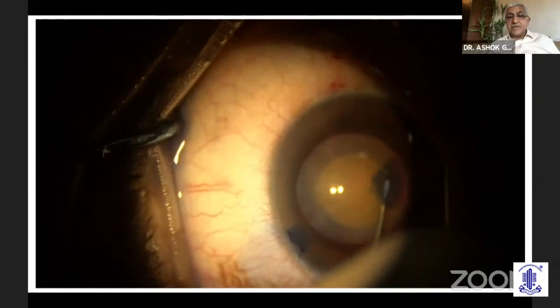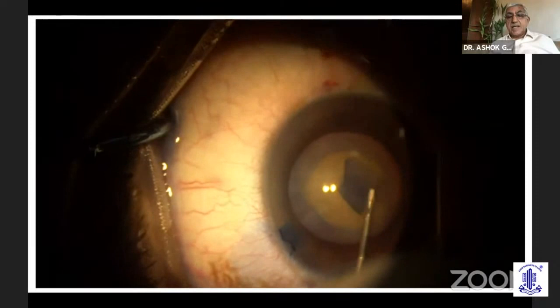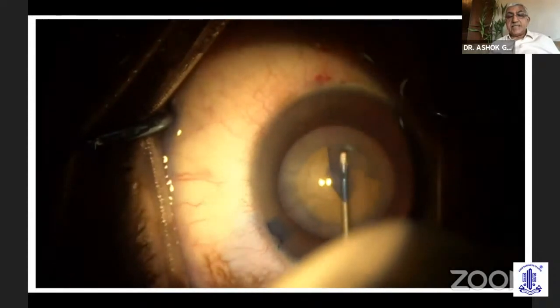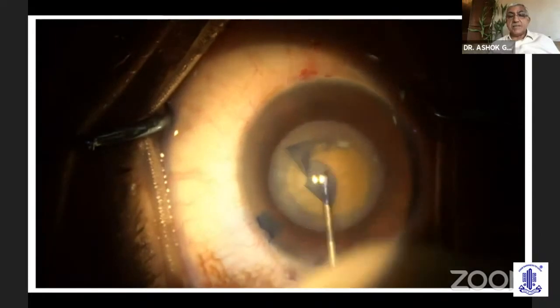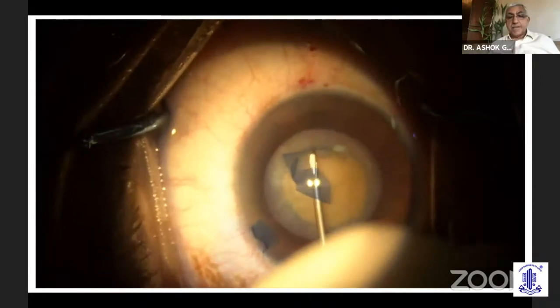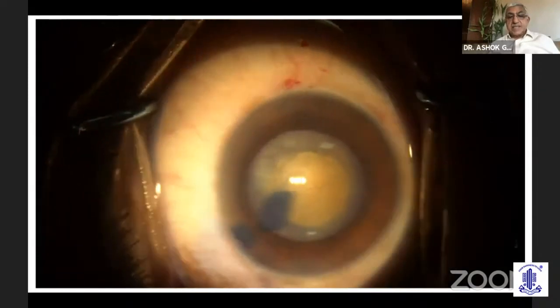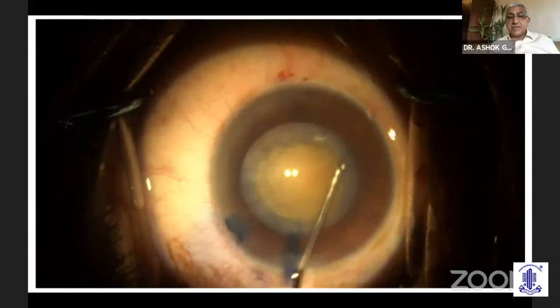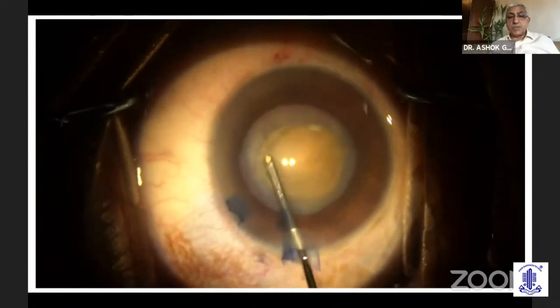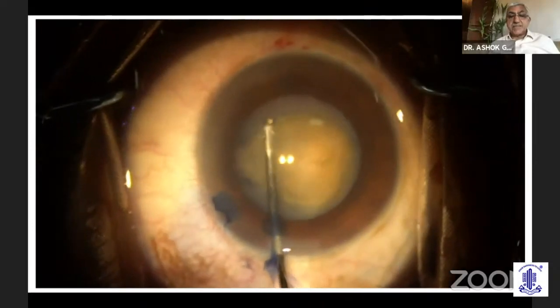And by the time we reach the end, we decide that we can spiral it a little and go on to increase it to about 4.5 to 5 millimeters. We are spiraling it and completing the rhexis. Now at this stage, we are reasonably satisfied with our rhexis and we do a hydrodissection through the main port with a small syringe with a backward pressure, but it seems that at this moment something happens.